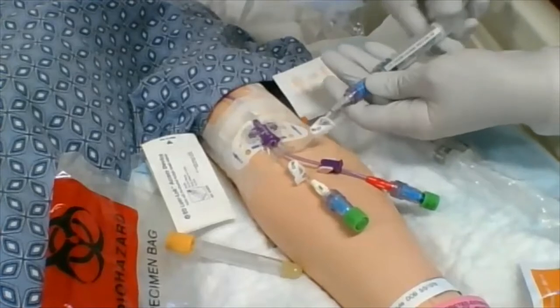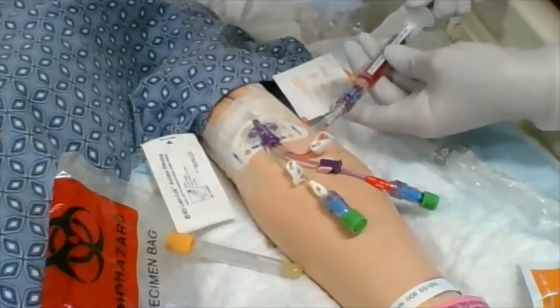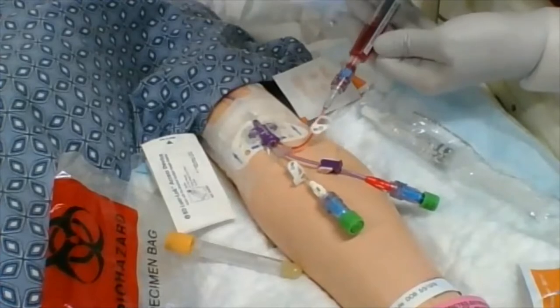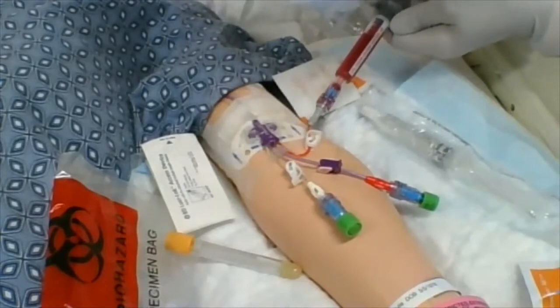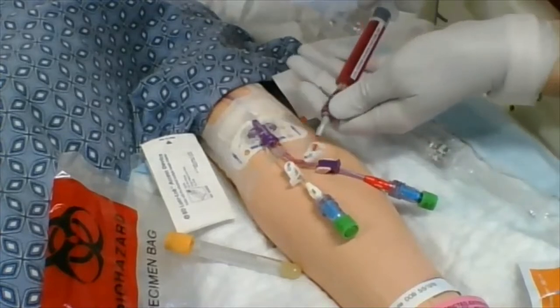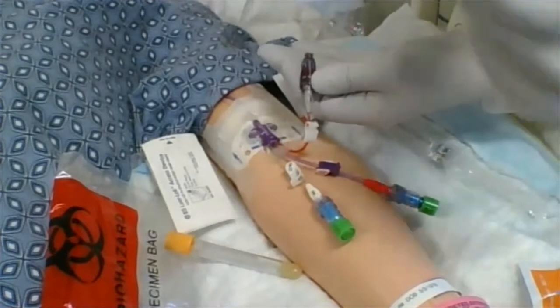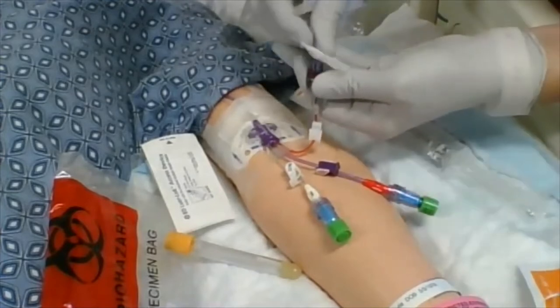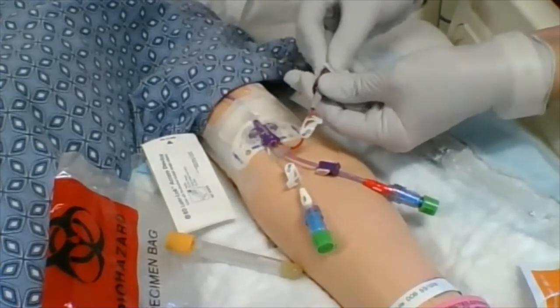Clear the line with saline. I'm going to pull back to make sure I'm getting a good blood return — enough blood to clear this entire line because it is quite long. It's coming out nice and easy. I get my full 10 ml out. I'm going to treat this as waste, so I'll clamp first and then disconnect. Discard. Alcohol again — 15 seconds.